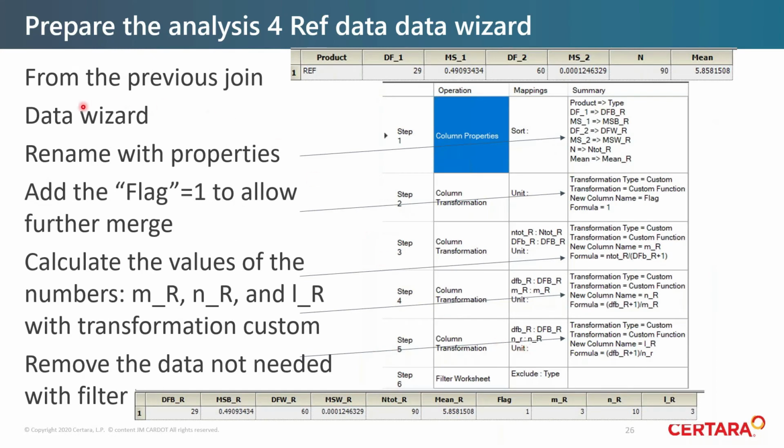Based on that, what I'm going to do is to rename everything and to make my calculation to have my M, my N, and my L. It's very important when you do it to have a name which is going to be easy to be connected with what is in the budesonide guideline.